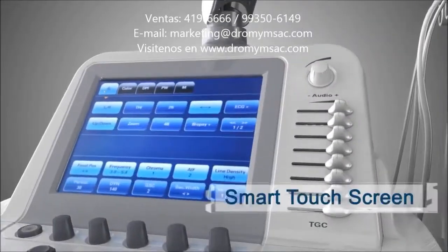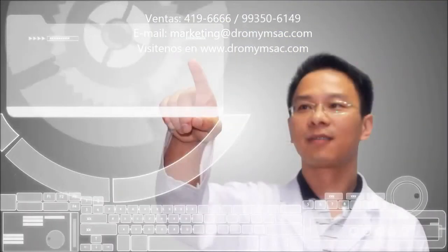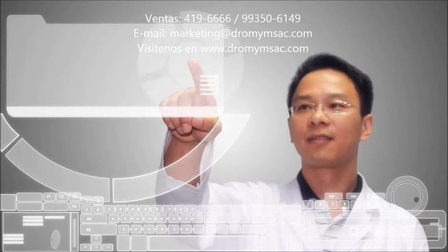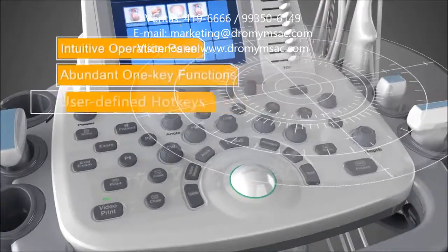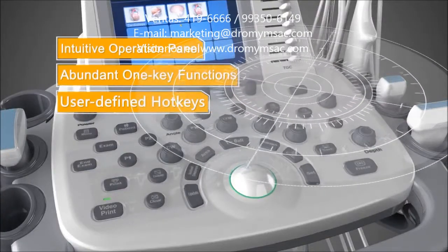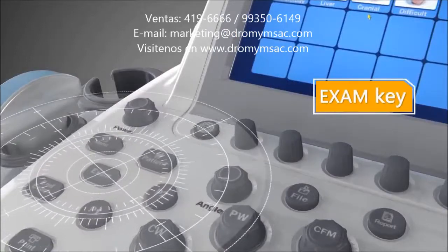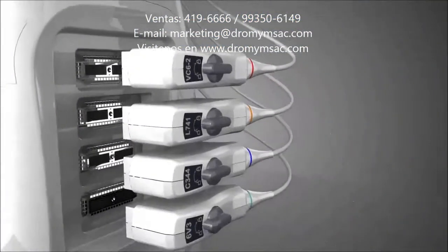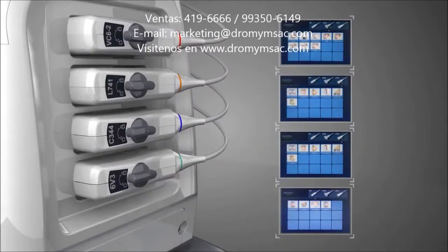A smart touchscreen for easy operation. Touch and press, S20's streamlined workflow makes it clear and simple. An intuitive operation panel, equipped with abundant user-defined functions. The exam key allows fast switch between different applications. Four transducer sockets support multiple connection and hot swapping.